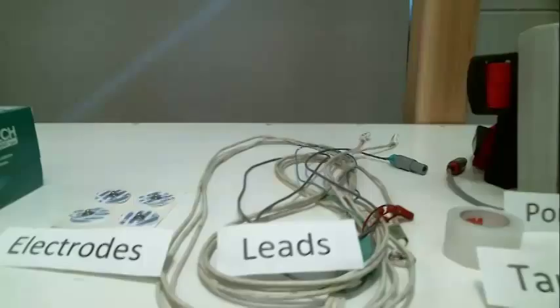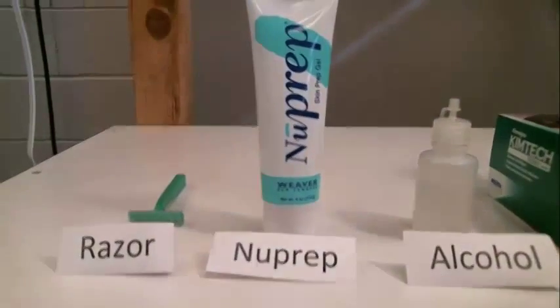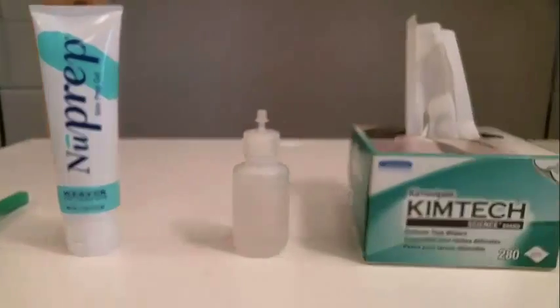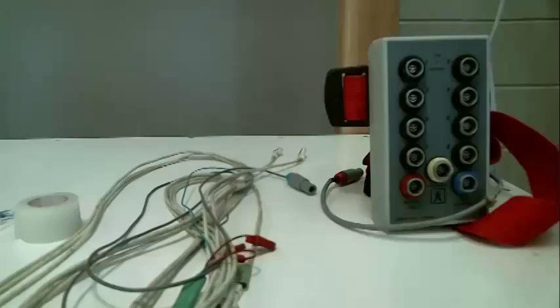Before you begin, make sure you have the necessary tools: a razor, Nuprep, alcohol, Kimtech wipes, electrodes, tape, leads, and a portable unit.